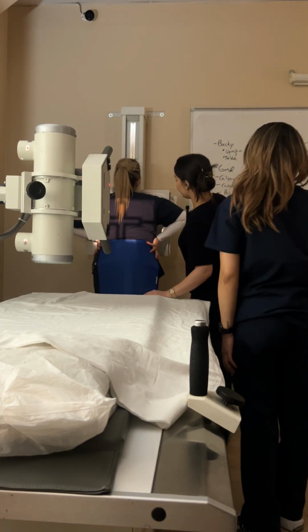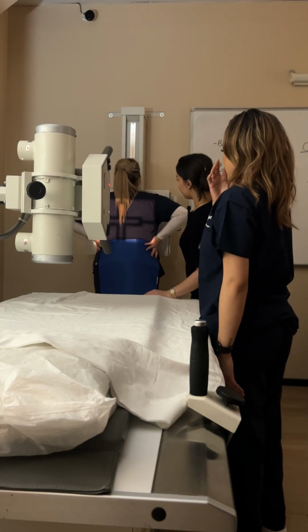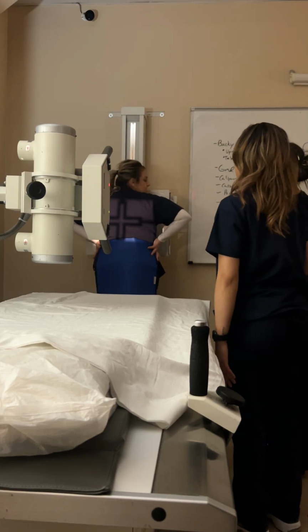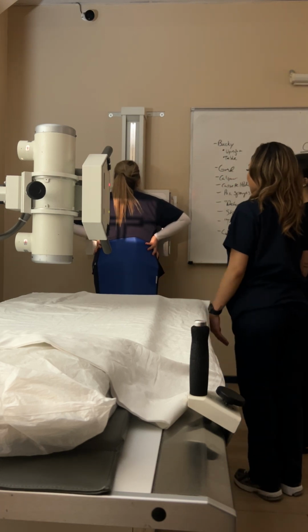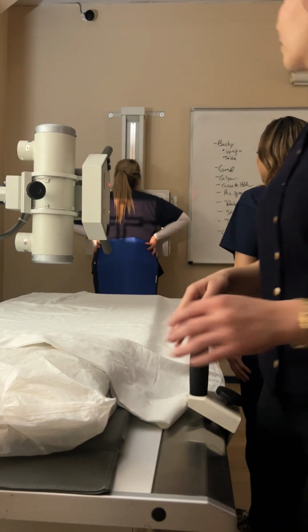But it's aligned, so. Okay, just roll your arms forward for me. And put your chest to the board. Got it. Okay. I'm going to take two images. Breathe in. And then exhale for me. And then take another deep breath in. Hold it. Don't move.